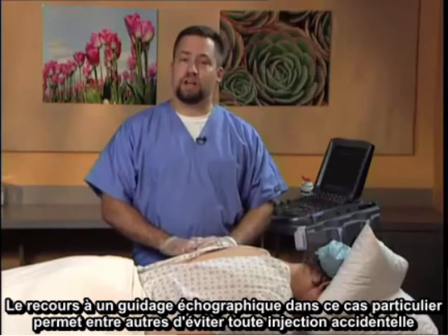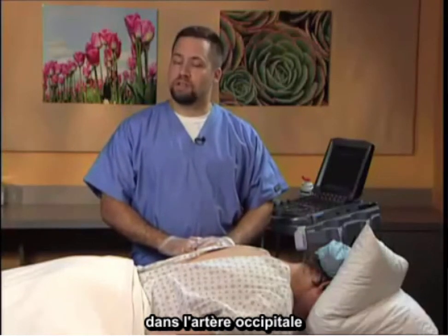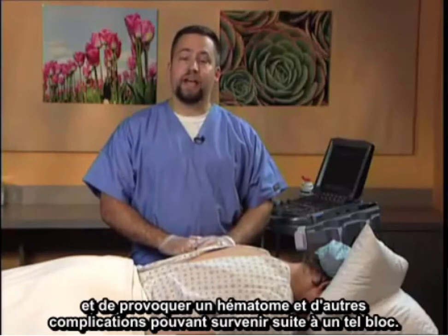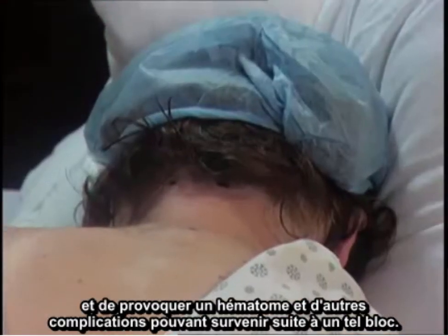Part of the reason to utilize ultrasound in this case is to avoid accidental injection within the greater occipital artery, as well as hematoma and other complications that can occur from this block.